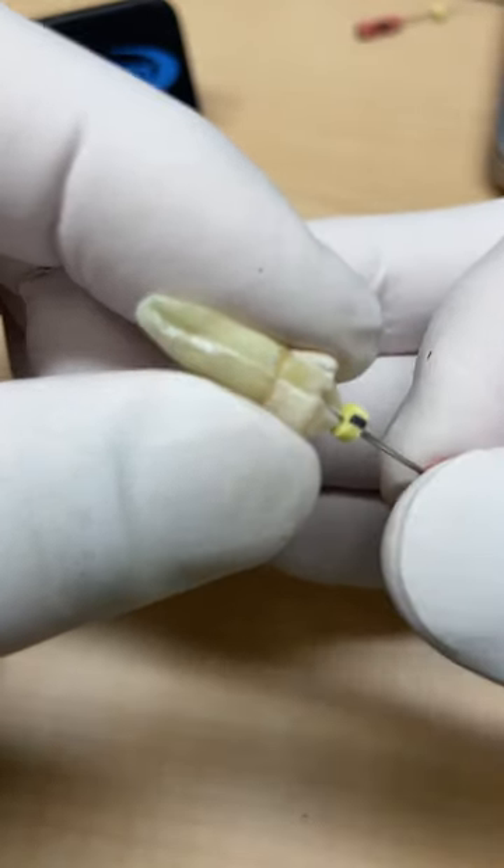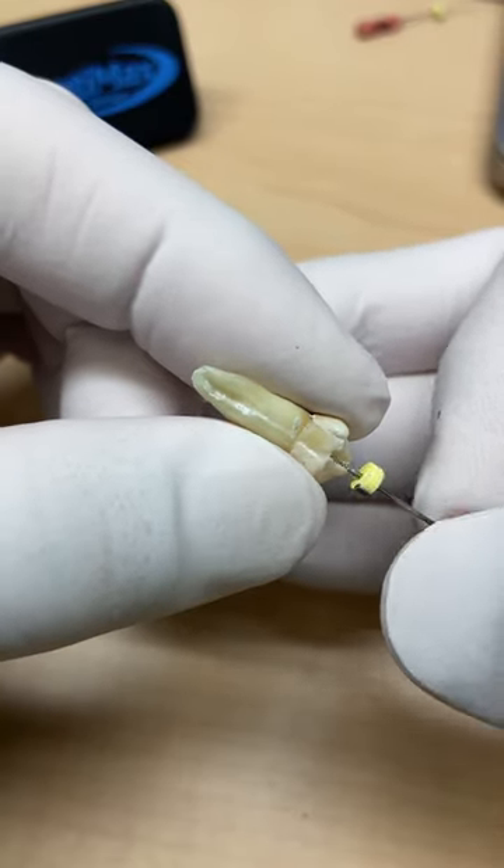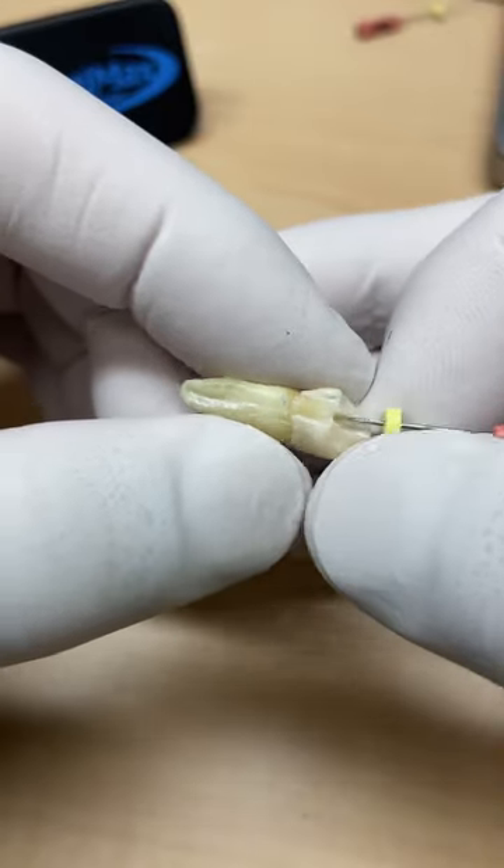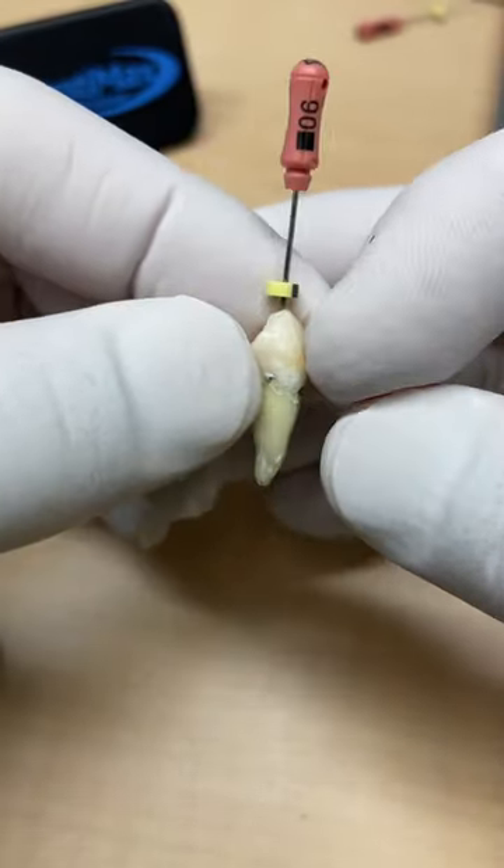Oh, there it is right there — boom! If you're doing mandibular premolars, you might want to grab a cone beam because these are tricky teeth.